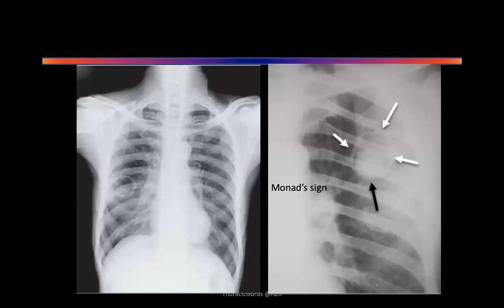Yes, sir. So this is a chest X-ray PA view, which is showing a cystic lesion in the middle zone of the right lung, and on close-up view there is an air crescent which we can see in that cystic lesion. The surrounding lung on the right side appears a little hyperdense, could be surrounding consolidation, and on the close-up view there is a solid lesion which seems to be inside the cystic lesion.